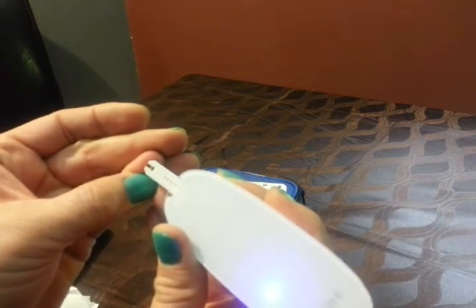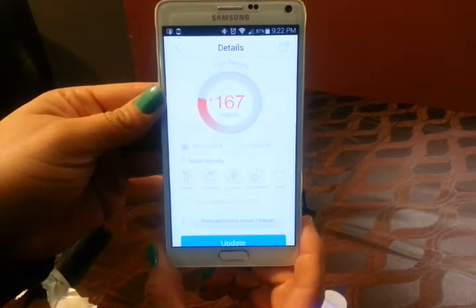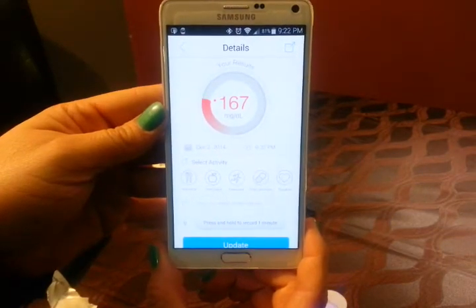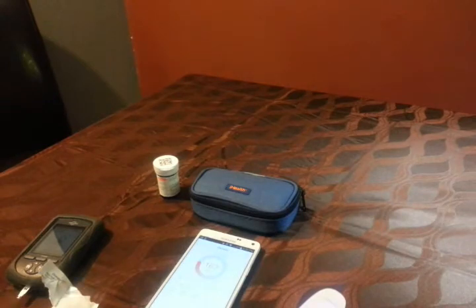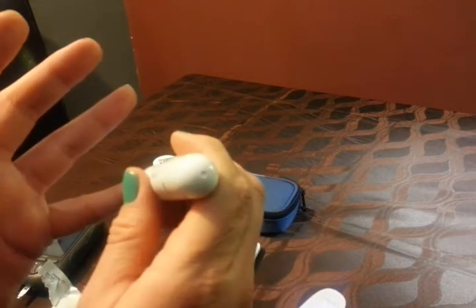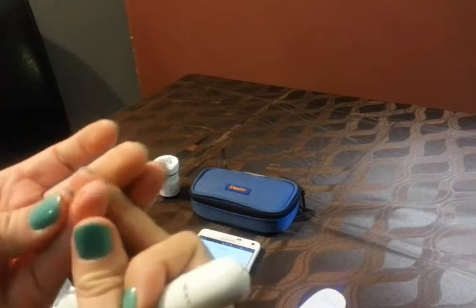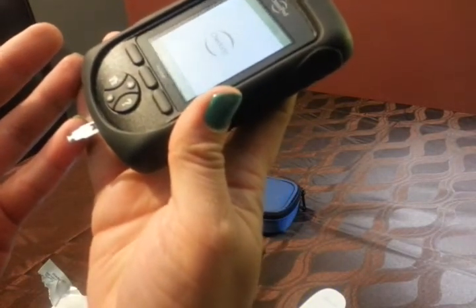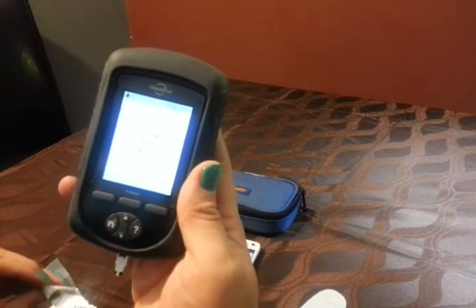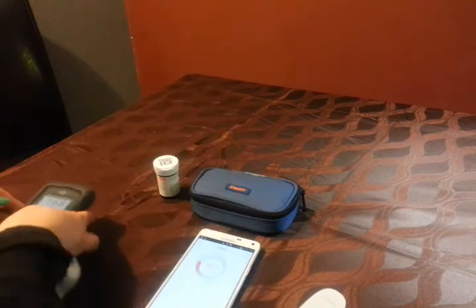I don't even know if there's enough. It's saying I'm 167, which I don't believe, actually — or maybe. I ate some peaches. Really close — Omnipod says 168. Cool.